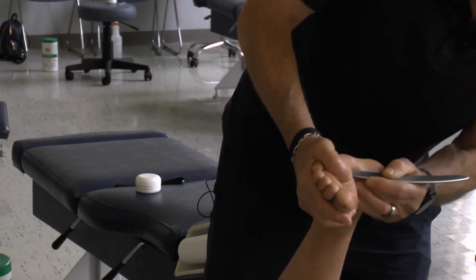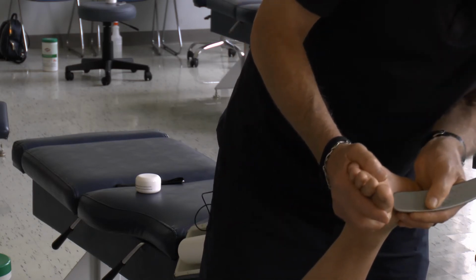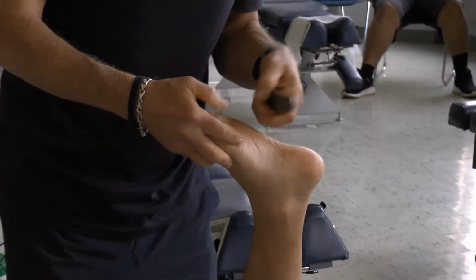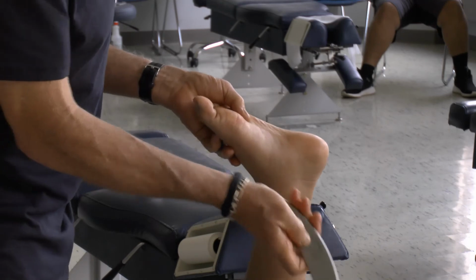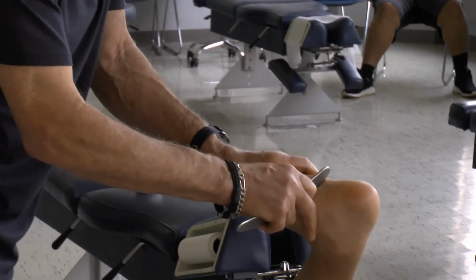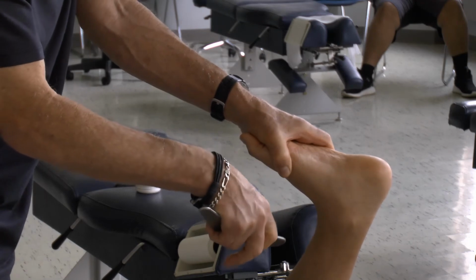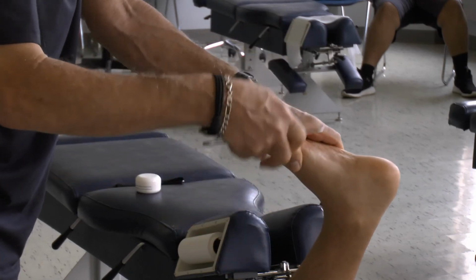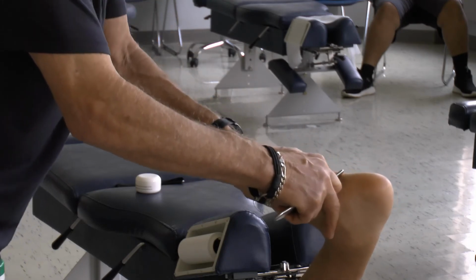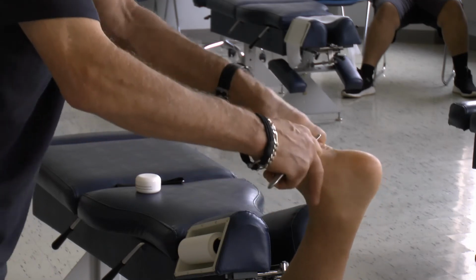Using some C curls, if you will, just coming across, making a shallow C across the tissues, working my way back towards the heel. I'm going to switch over to my convex edge and get a little bit more aggressive here. If it's more comfortable, this can also be done with the leg in a straight position, the table all the way up. I have it elevated like this so the camera can see it. And that's very crunchy right there. So I'm just ironing it out with the ConnecTX instrument.